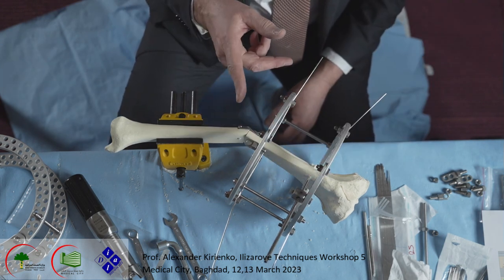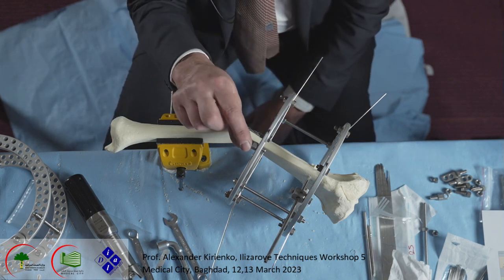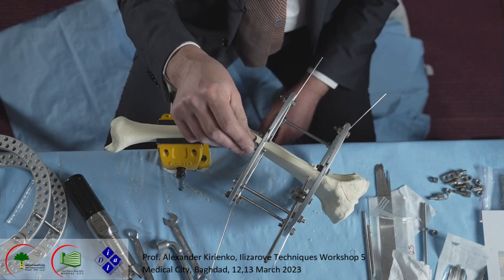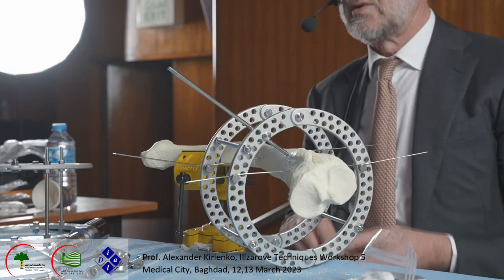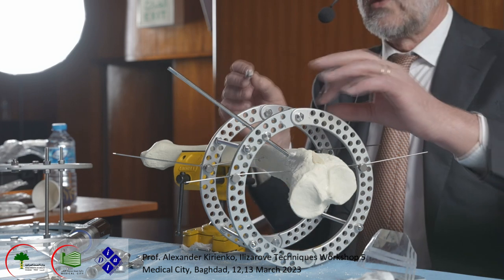Like you see here now, I put one hole post, but it's not enough because it's short. We need a little bit higher post, okay? Because it will be at the level of deformity.